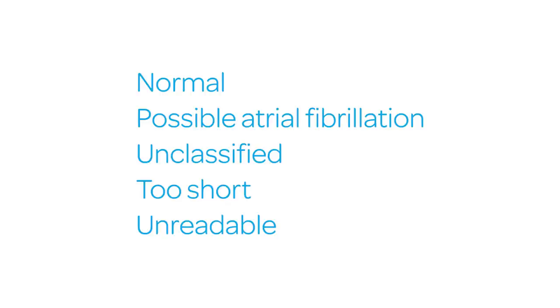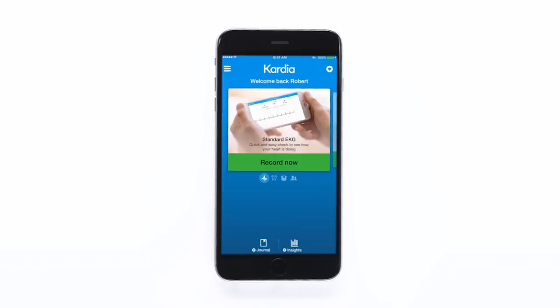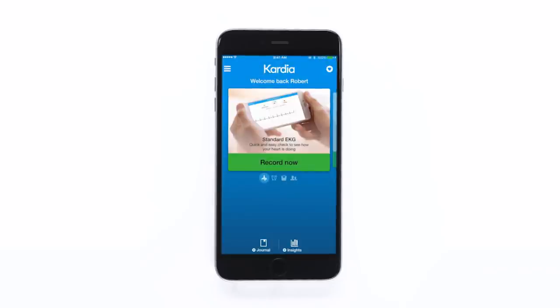For more information on these possible results, please review the user manual available on our website at alivecor.com/quick-start. Make sure your iPhone's Bluetooth is on, so your ECG recordings and analysis from your Apple Watch are synced to your iPhone Kardia app, so you can access your results anytime, all in one place.